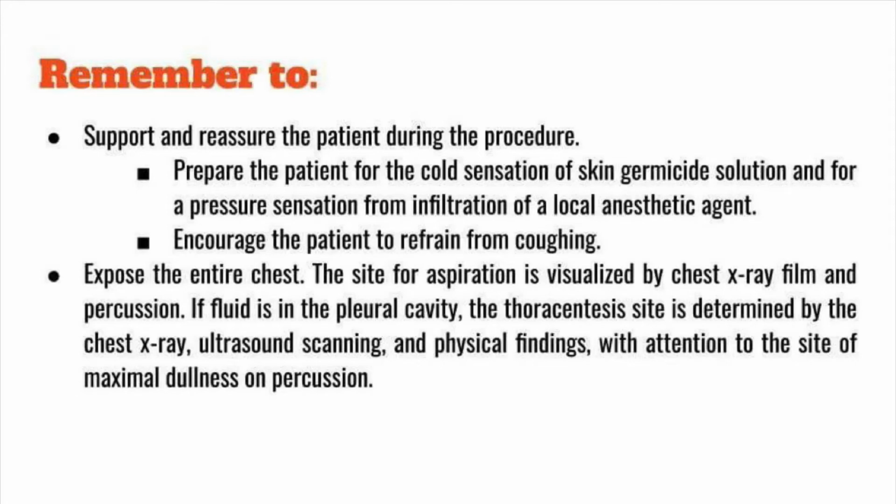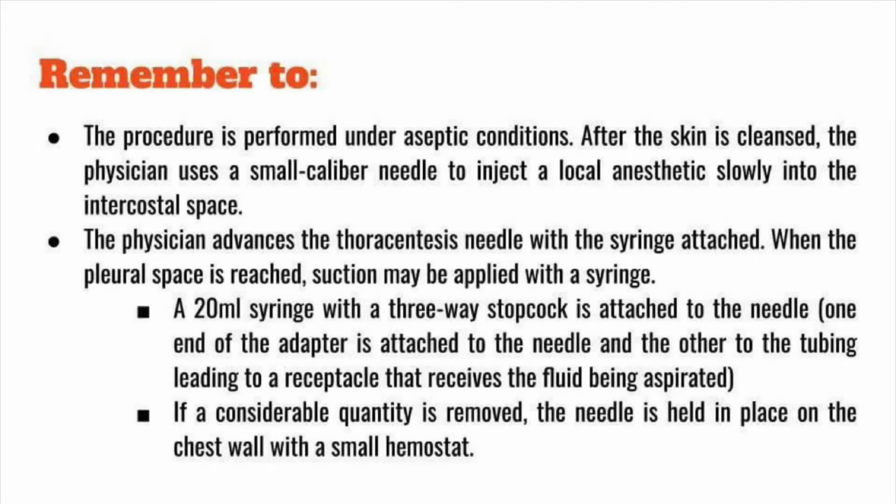Expose the entire chest. The site for aspiration is visualized by chest x-ray film and percussion. If fluid is in the pleural cavity, the thoracentesis site is determined by the chest x-ray, ultrasound scanning, and physical findings, with attention to the site of maximal dullness on percussion. Remember that the procedure is performed under aseptic conditions.